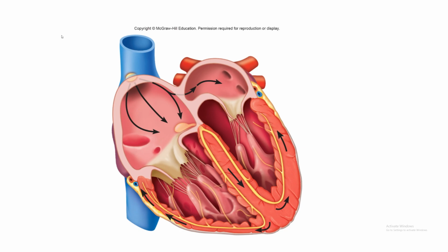So in your top right electrode, or your RA, right arm, up there, that electrical signal is going to be negative, right? And down here, this electrode, your lower left one, is going to be positive. So that signal is more positive down here and more negative up here, right? And so as that positive charge moves towards your positive electrode down here, that's when you're going to get an upward QRS deflection, an upward P wave. That's why those are up, right?